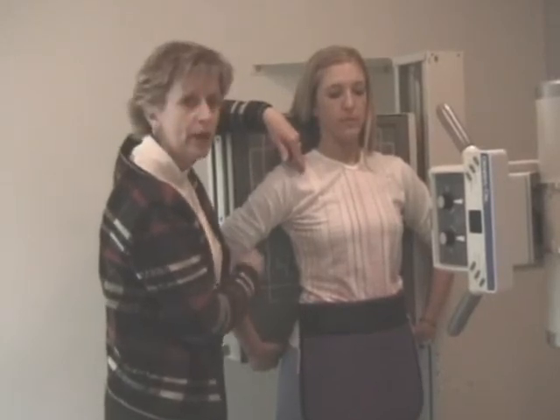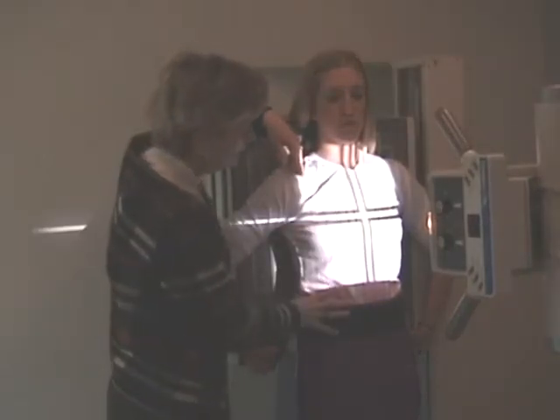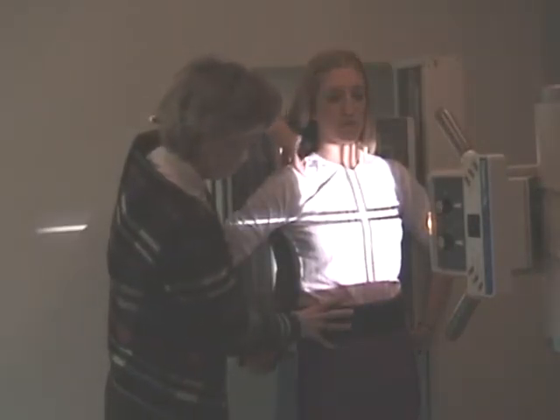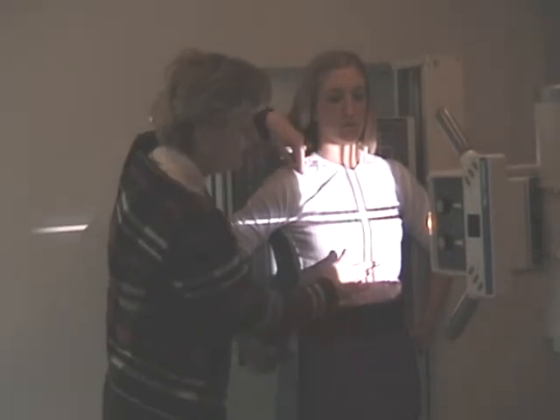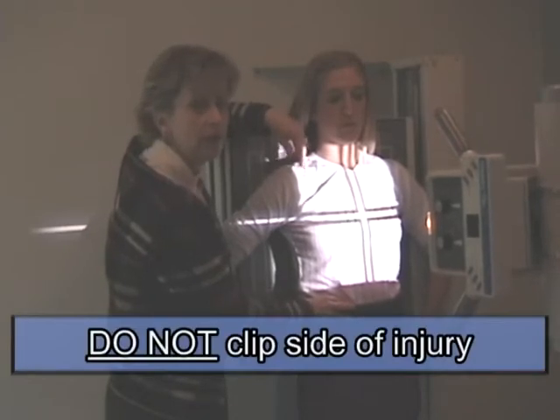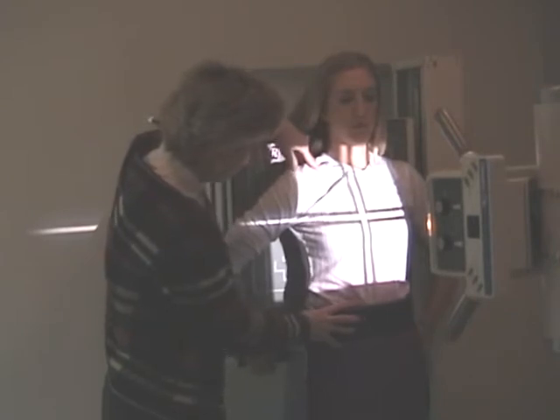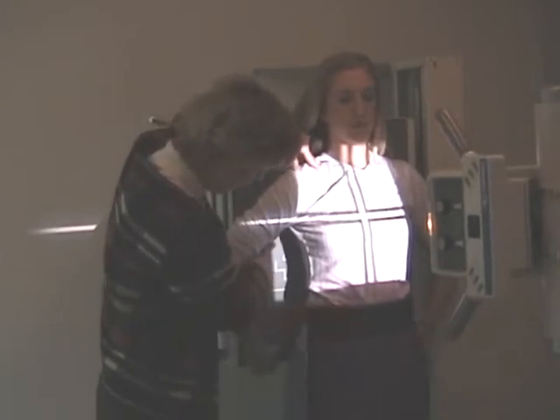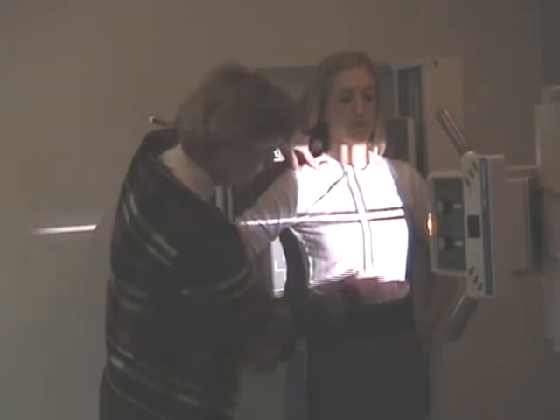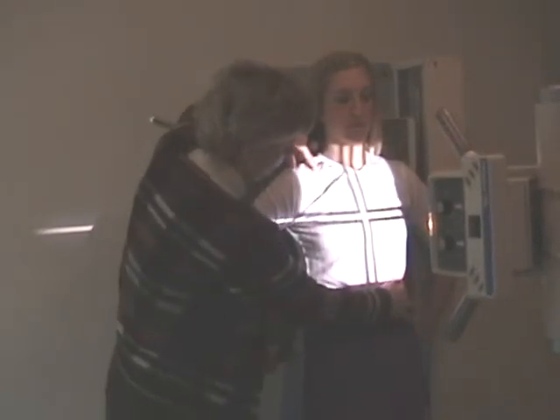If she was a large patient and broad in shoulders, broad in the thorax, you might have to offset the patient a little bit. The part from reference point states the mid-sagittal plane to the center of the film. However, do not clip the site of injury. So you might just have to offset them a little bit, but look what would happen if we offset Kristen an inch. See how much tabletop we're x-raying? And that is not valuable information. So we're going to use the shadow of our light a lot during this demonstration.